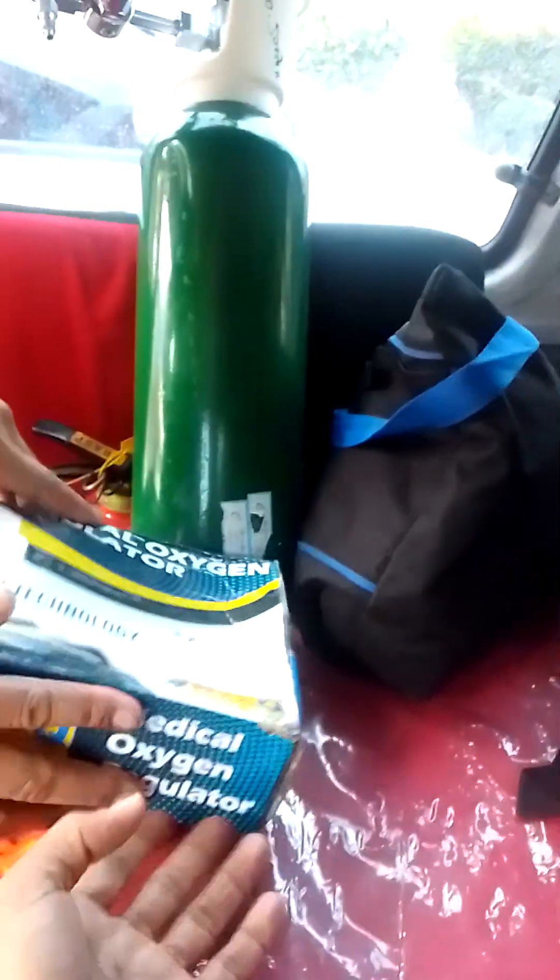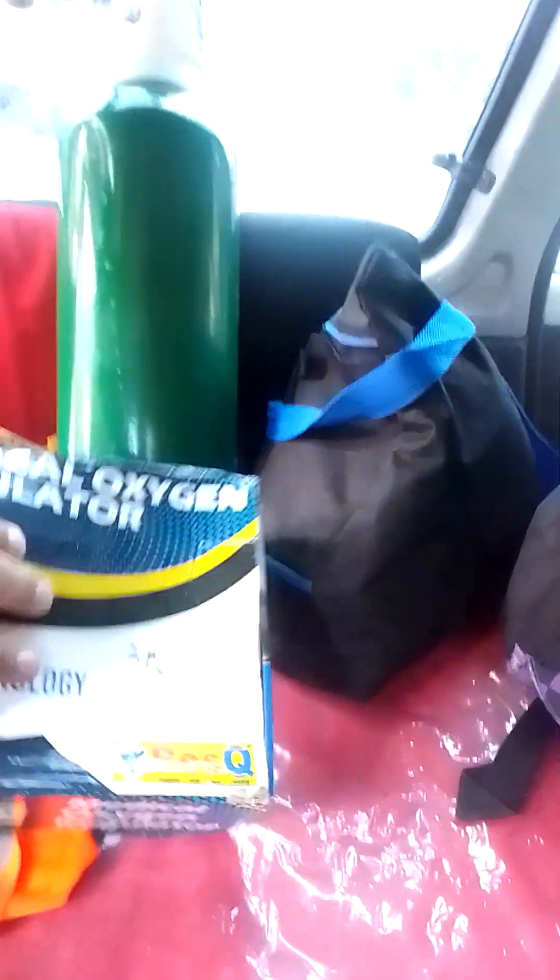So it's very handy, about 7 kilos. Basically I have the Medical Oxygen Regulator here — the right tools.